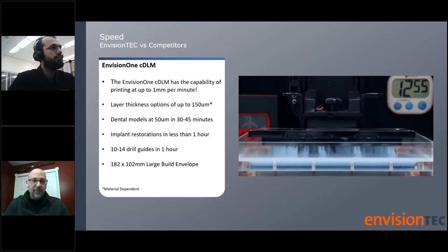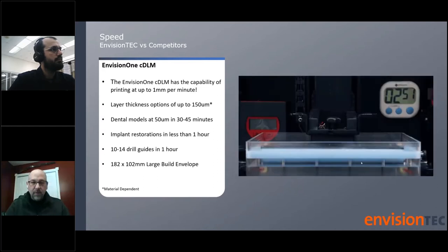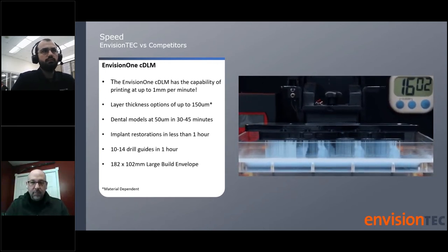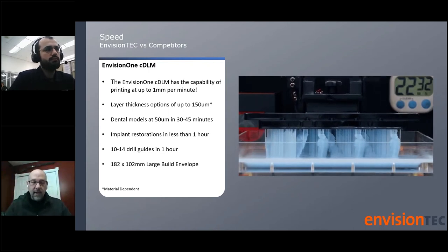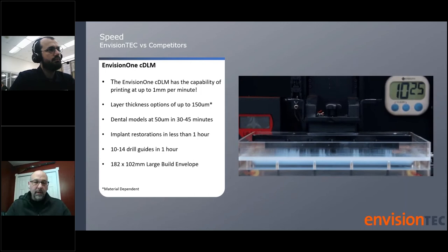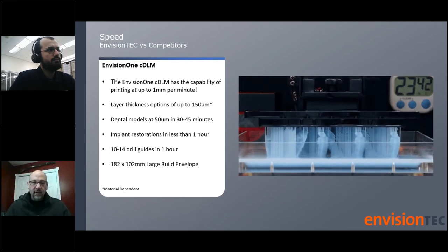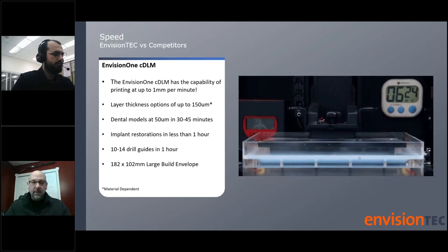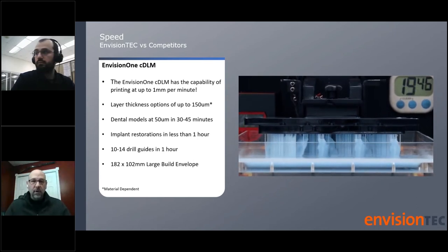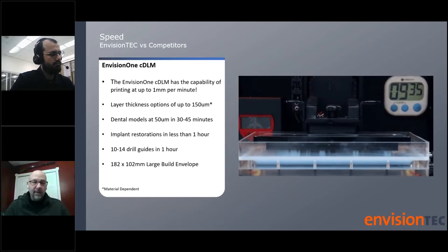One of the things we want to talk about first is speed. This is a visual of the Envision One printer actually producing a full plate of parts in under 24 minutes. Printing times can vary based on the size and orientation of the parts as well as the materials. The Envision One is a very fast printer — 10 to 14 drill guides in an hour, eight to 10 denture bases in under an hour. We even have newer materials that allow orthodontic horseshoe models to be produced in well under 15 to 20 minutes, at a very high level of accuracy.